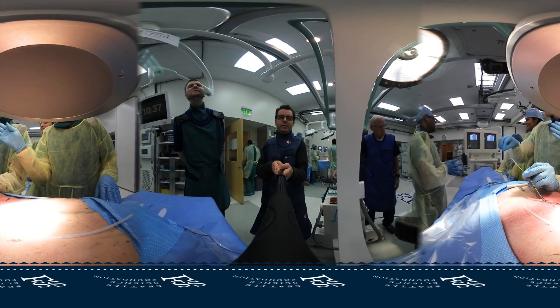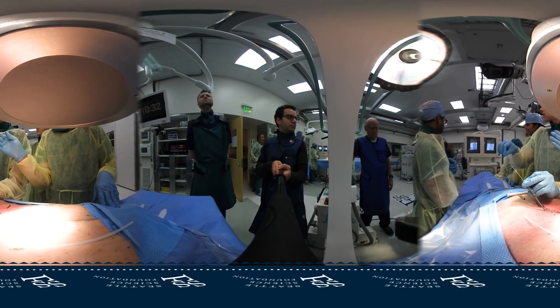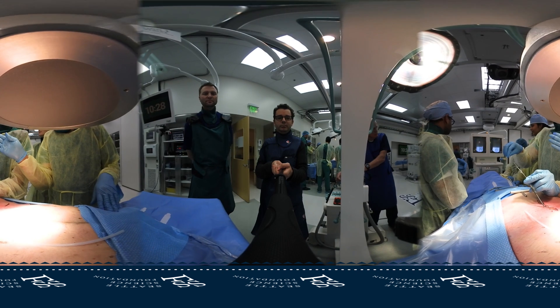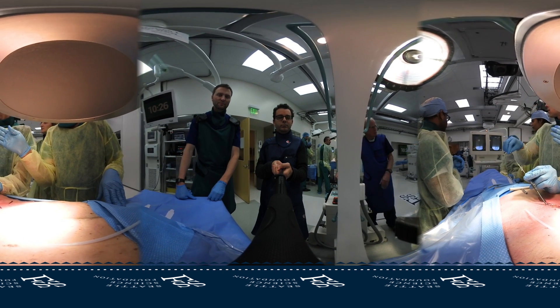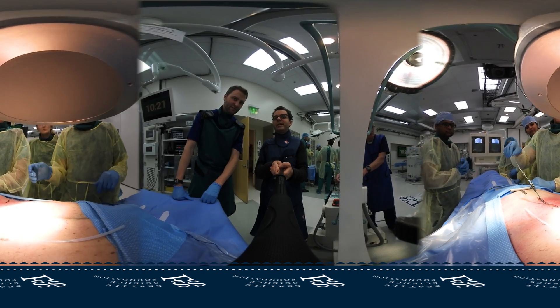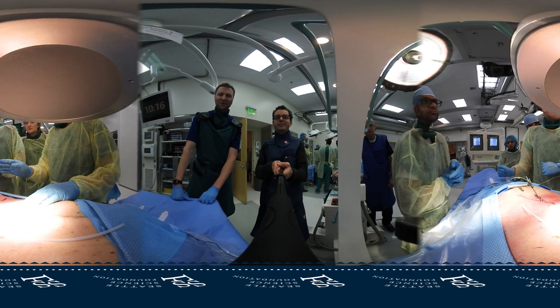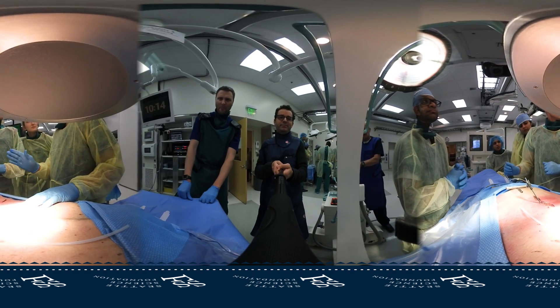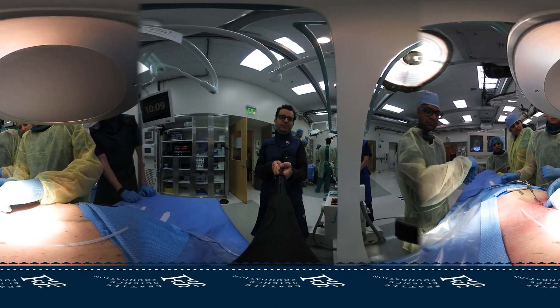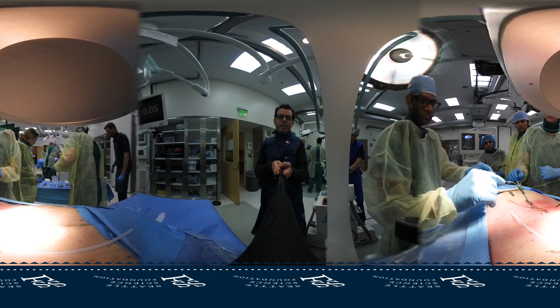Don't advance — wait. It's not going where you want to. That's not midline, so pull back a little bit. Look at the top of the next vertebral body then stop. You're doing everything right. It's basically like a 360 camera. Now what I would do is use the fixate device. But if we don't have the fixate device, we put two sutures down. Your anchor's on the move.